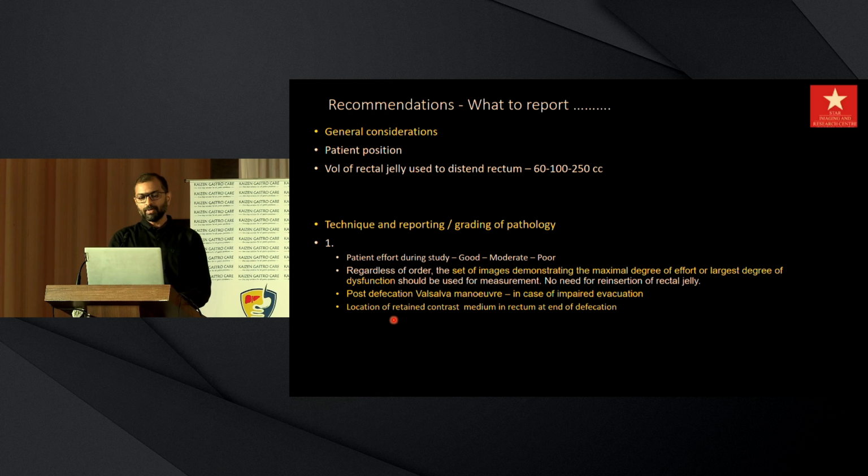So on recommendations, the guidelines that have been provided on what I need to report as a radiologist during an MR defecography start with the patient position. There are some systems which are available, not in India, wherein the MR can be done with the patient in the standing or the squatting position. There is another guideline on the amount of rectal jelly which has to be used to distend the rectum.